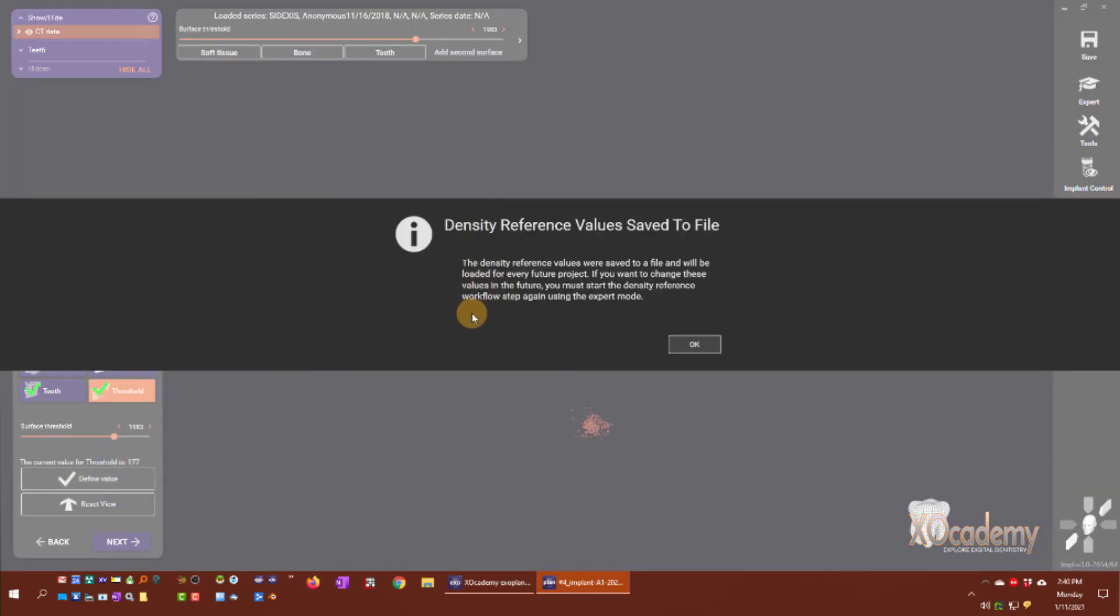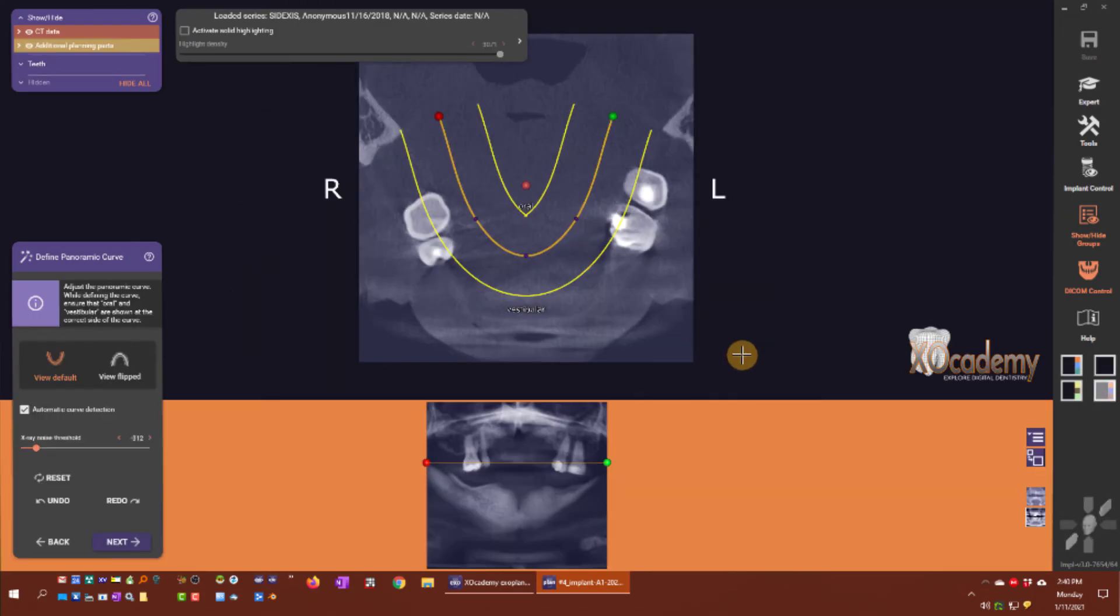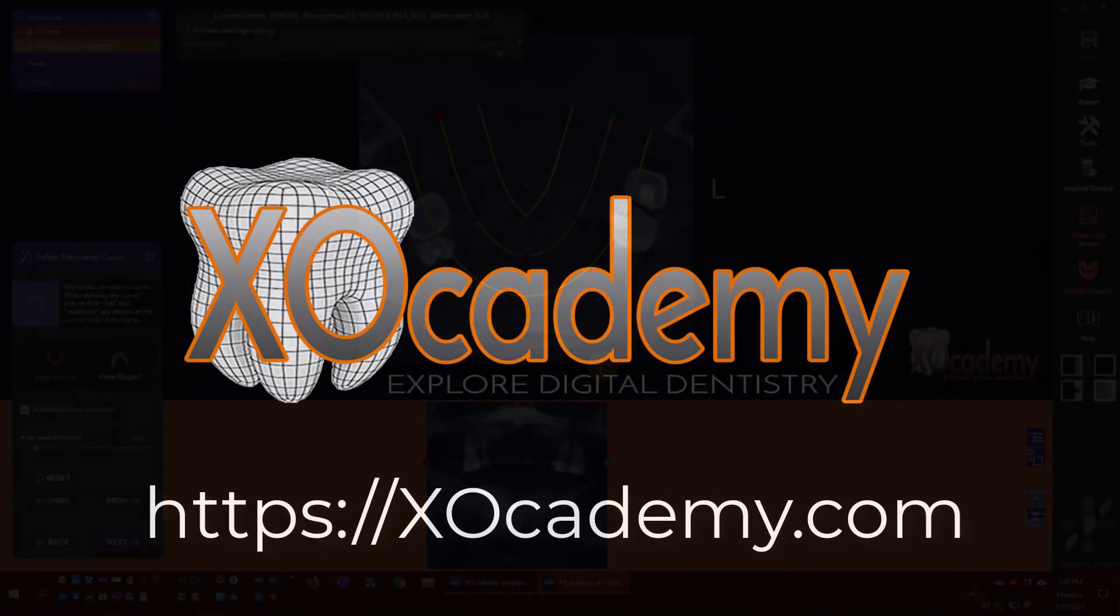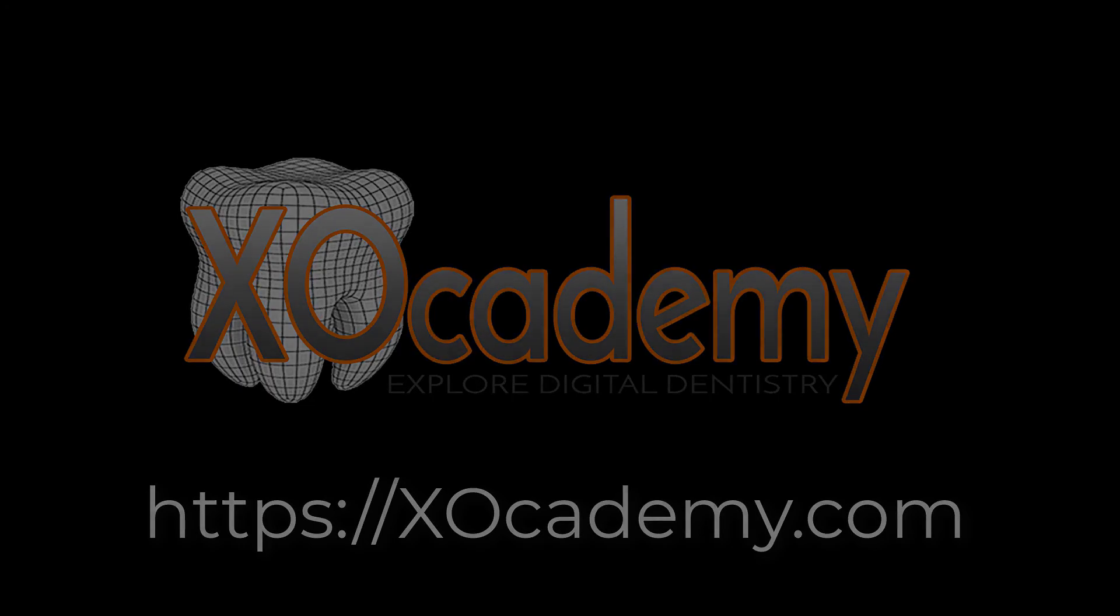That saves those four reference values to our case. We just click OK, and that's when we move forward with define panoramic curve.